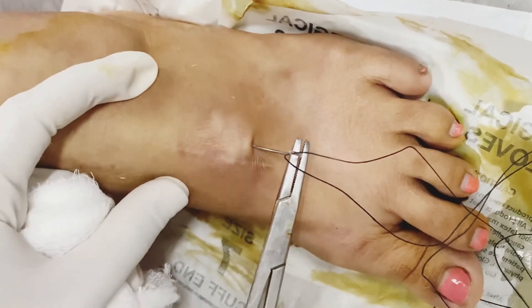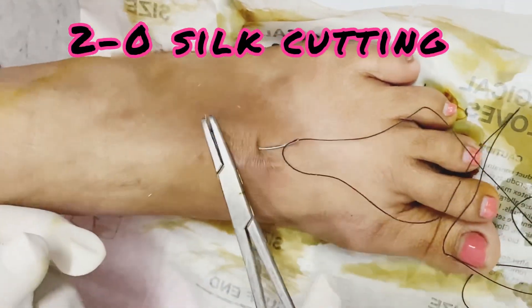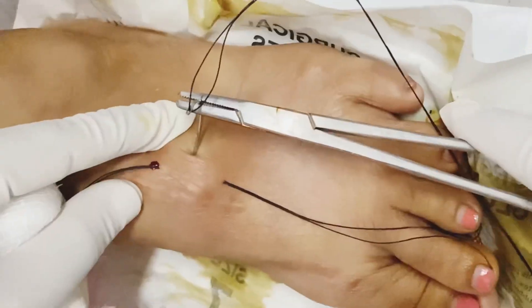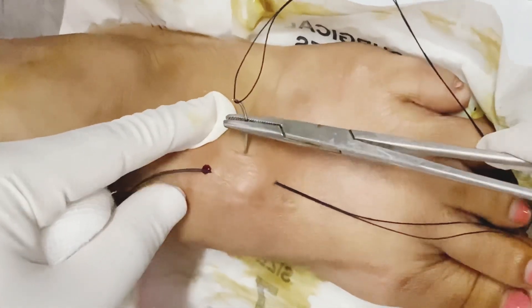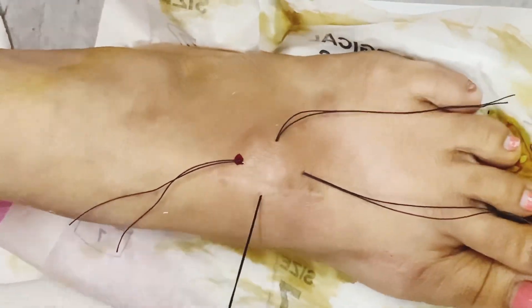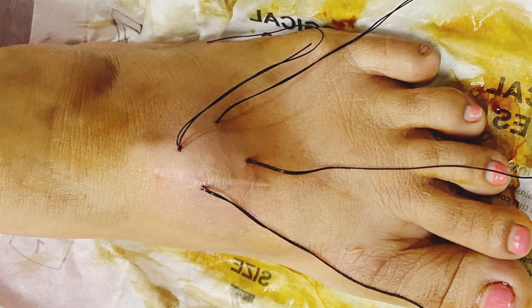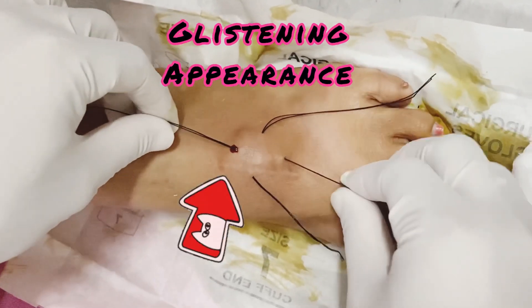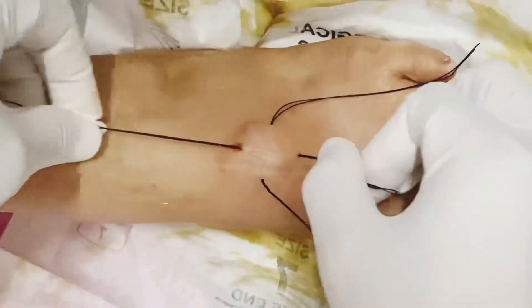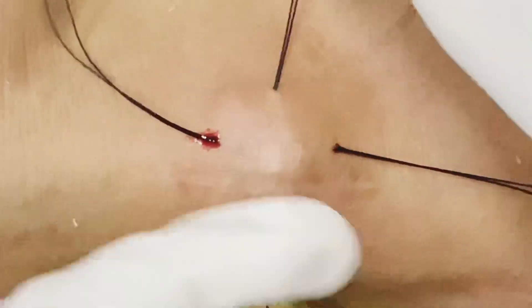A sterile silk thread on a cutting needle is passed through the cyst and taken out from the other side. The same procedure is done perpendicular to the first thread. The thread gets a glistening appearance as it comes out because of the mucin content, which confirms it passes through the cyst.